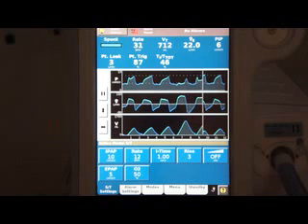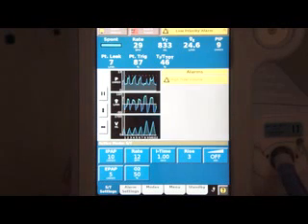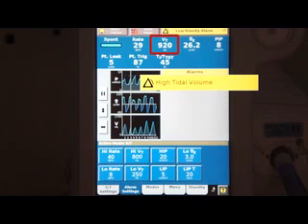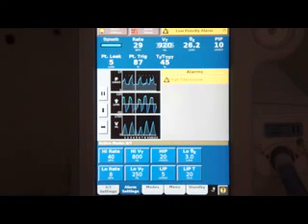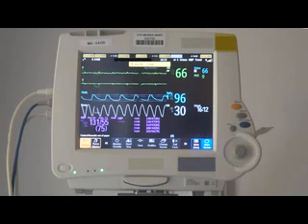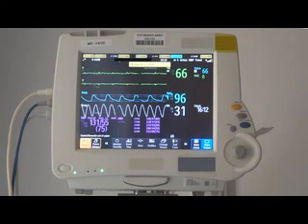Adjust the alarms in accordance with the clinical scenario and ventilator settings. Assess the patient whenever an alarm occurs. In this case, the patient's tidal volume is greater than the high tidal volume alarm threshold. If this tidal volume is acceptable, however, the alarm threshold can be adjusted. Monitor the patient's symptoms and vital signs closely, and adjust the FiO2 to achieve the desired oxygen saturation.